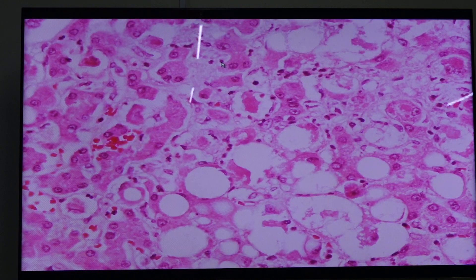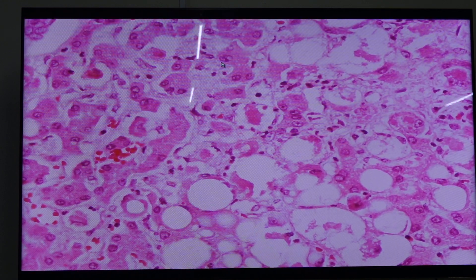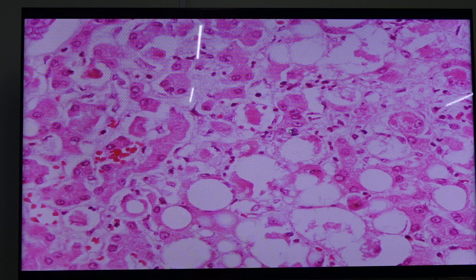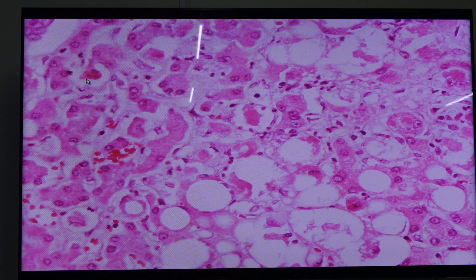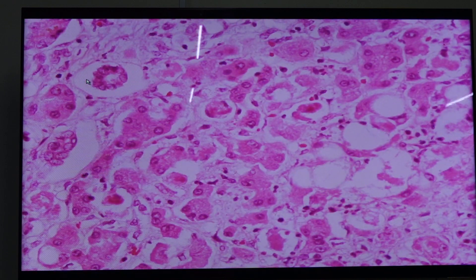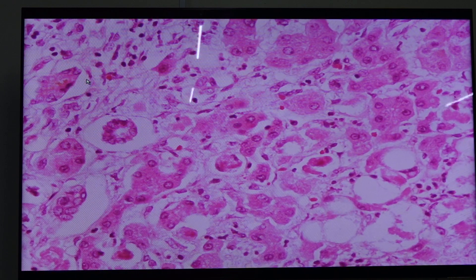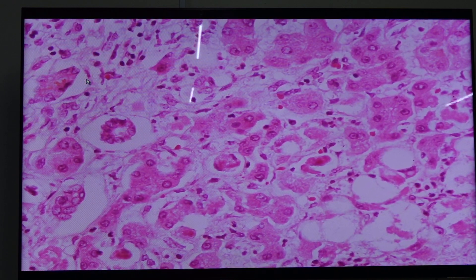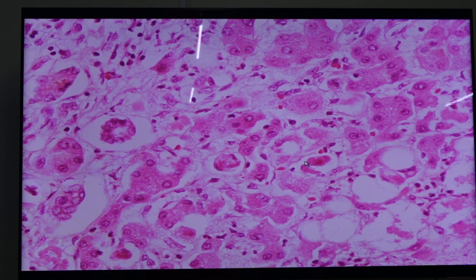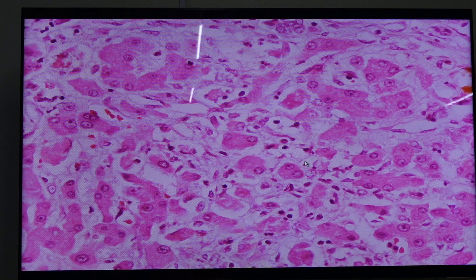Here we have a lot of them. This is a Mallory-Denk body, this one, this one, this one — Mallory-Denk bodies. What would be the differential diagnosis?